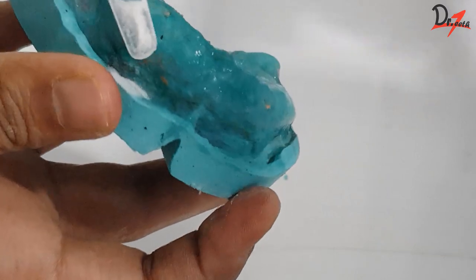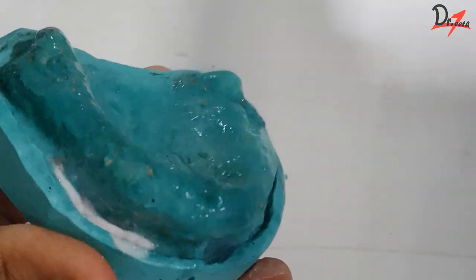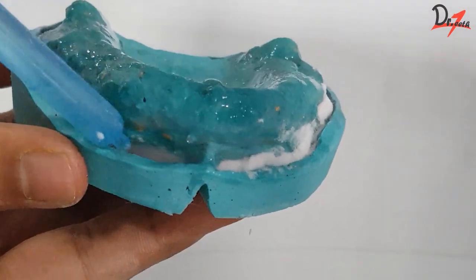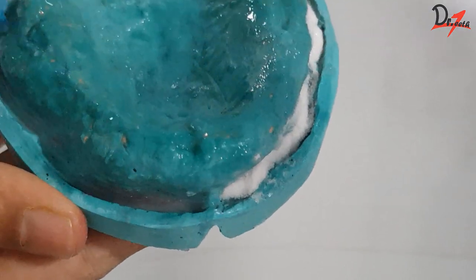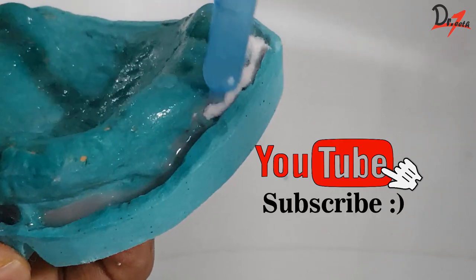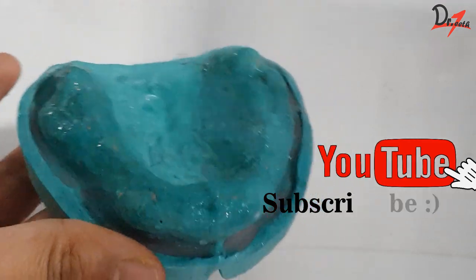We will start by sprinkling the polymer — that is the powder — in the sulcus all around. Then we will inject the monomer, that is the liquid, using a dropper as you can see here. Use sufficient liquid so that all the polymer is completely wet by the monomer. Then we will keep it aside.